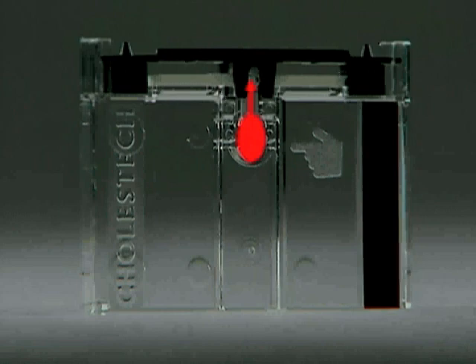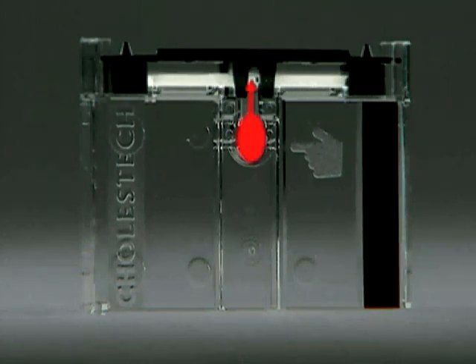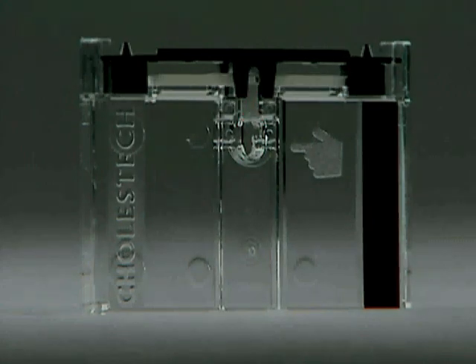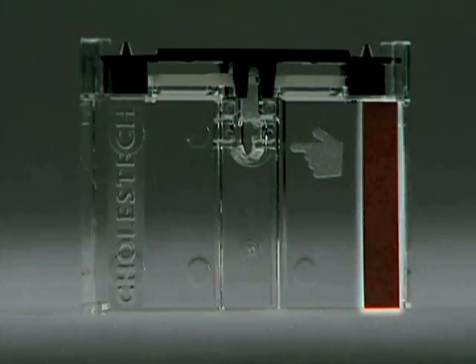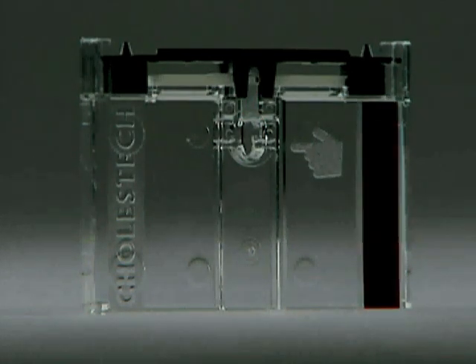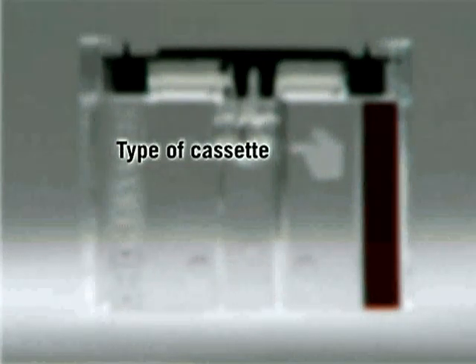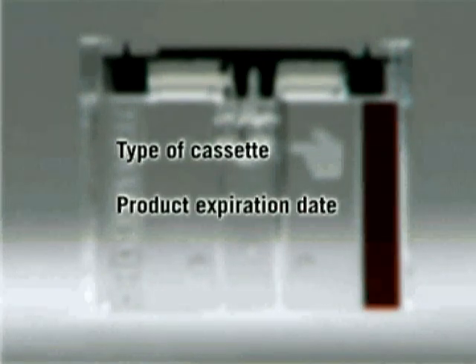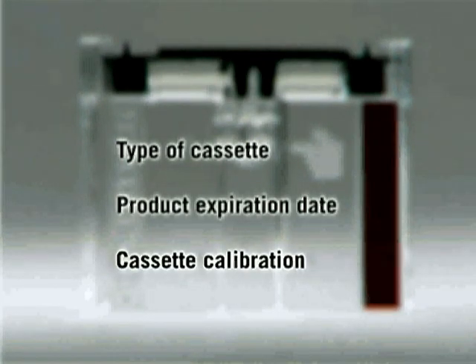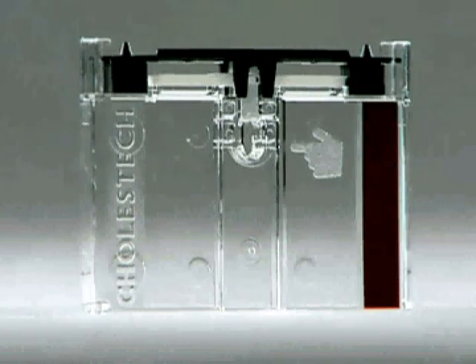Within minutes, the white pads on the reaction bar change color. The darker the color, the more analyte is present. The magnetic stripe is read by the analyzer and provides information on the type of cassette, the product expiration date, and cassette calibration. Avoid touching the magnetic stripe and the reaction bar. See the package insert for proper storage and handling information.